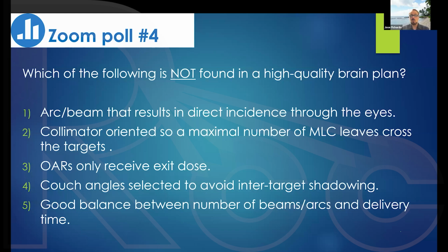Okay, so here you're looking for what you do not want. A lot of these things you want, but there's one that you do not want. And the key factor here is high quality, right? You can have a lot of clinically acceptable plans that may have all of these things, or some of these things may be missing, right? But we're looking for the high quality. We want the best plan for this patient.